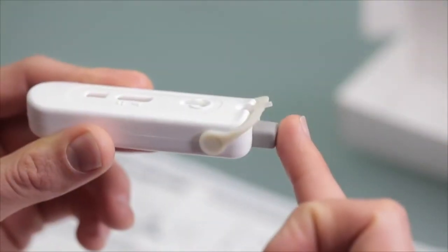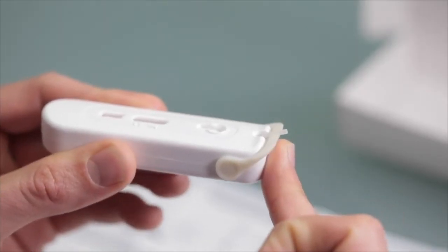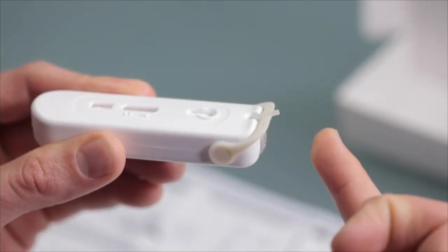Firmly push the grey button in to prick your finger. Remember, it only pricks once. Don't worry, to most people the prick feels like a rubber band snap against the skin.